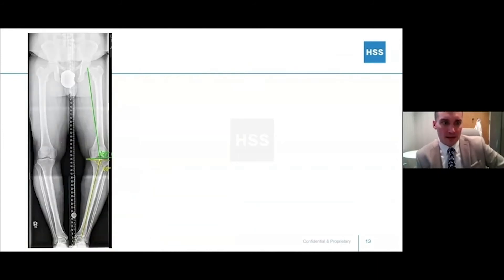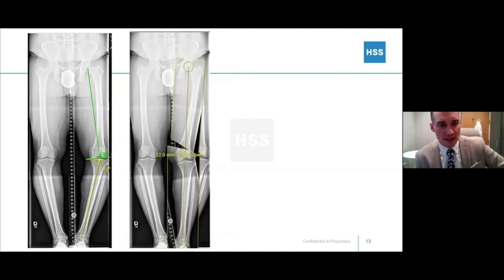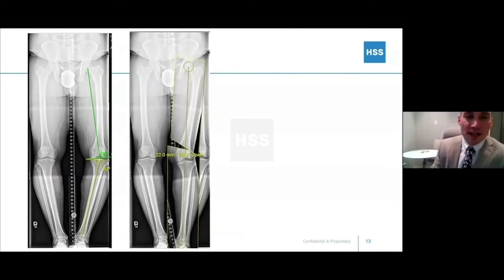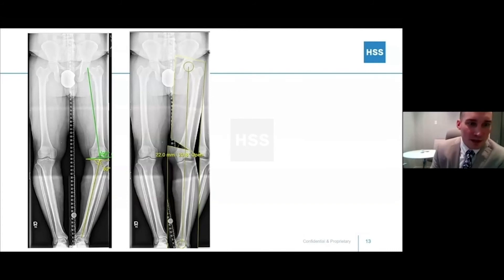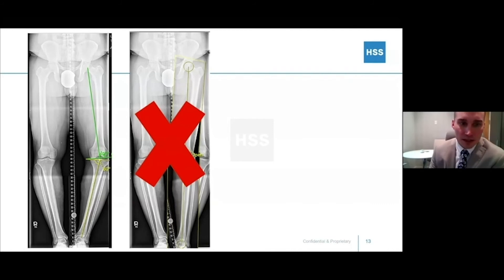Looking at the joint orientation angles: 93 degrees is abnormal in the femur, and the tibia is also abnormal. If you just let the computer calculate it, you'd get a 22-millimeter wedge at 20 degrees opening — but that's really too large. That's too much for a single osteotomy to do acutely. So we have to rethink our plan to something actually achievable in the operating room.